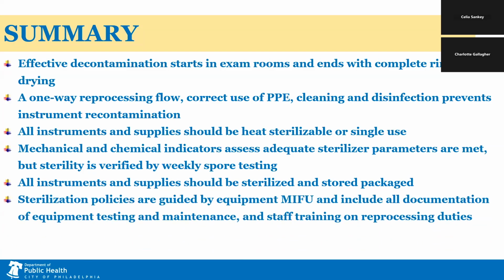And finally, sterilization policies are guided by equipment manufacturer's instructions and include all documentation of equipment testing and maintenance and staff training on reprocessing duties.